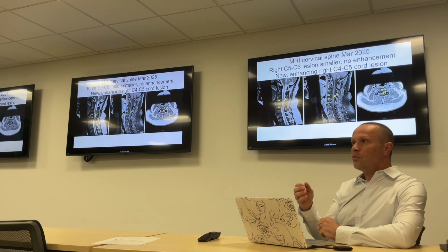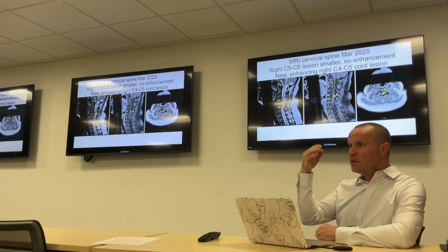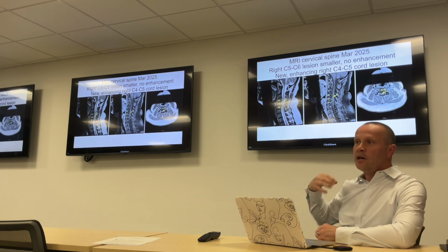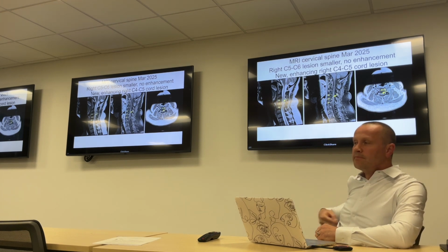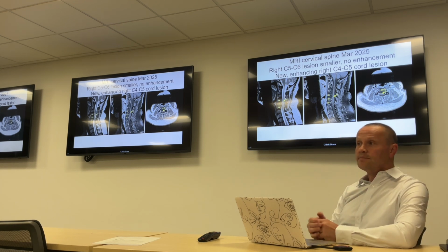So when we image the whole spine for MS, top to bottom, brain, cervical spine, thoracic spine, we don't need to do the lumbar spine though. Okay. Any of those things, like this is an MS lesion, this same patient might need a brain MRI too. Yeah.